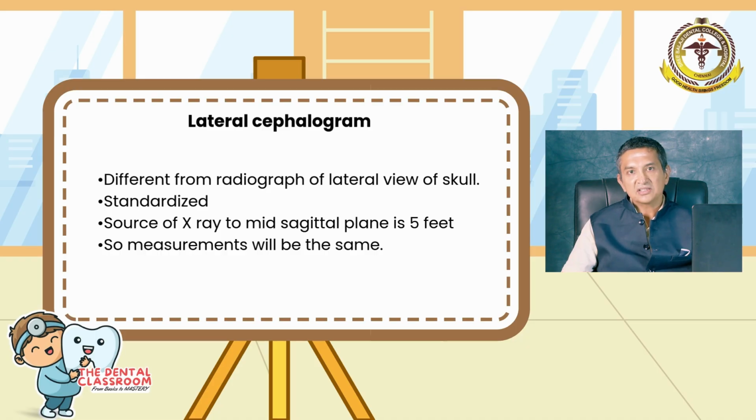So, the important advantage of taking it with a standardized machine is that these values will be exactly ditto whether it is taken in Madras, in Mesopotamia, or in Madrid. The standardized values will not change depending on where you take it.